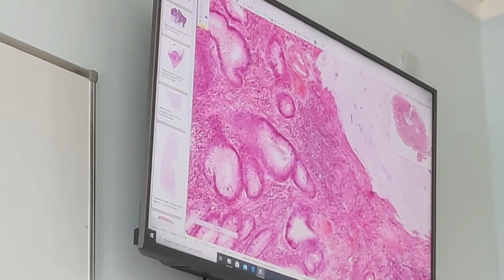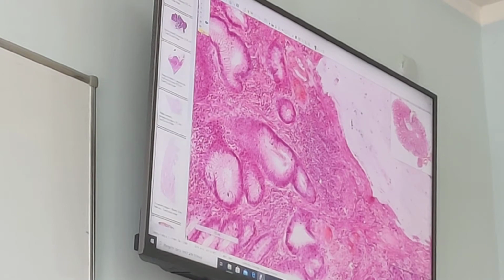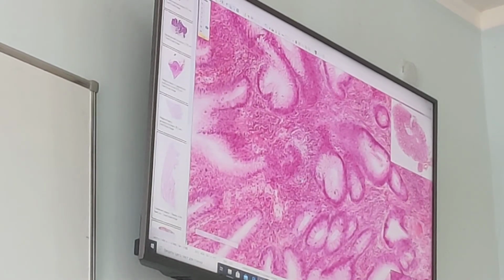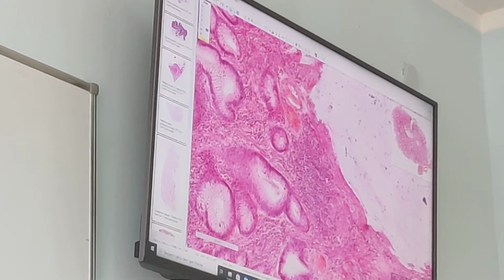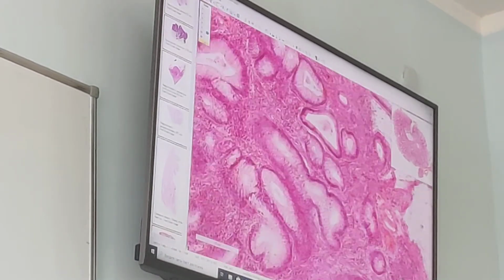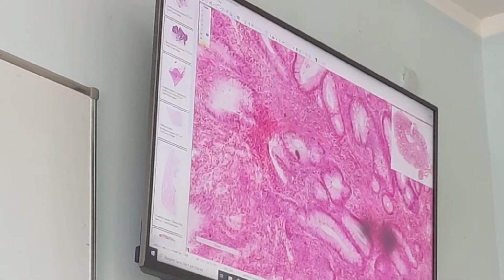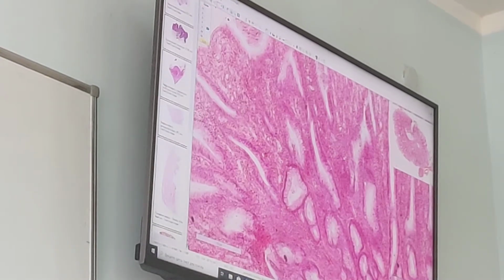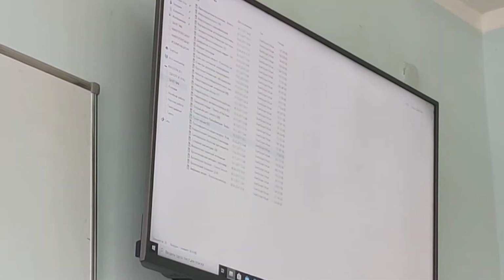Chronic inflammation is the main reason for polyp formation in any location of the mucous membrane. Foci of inflammation, it's not a single focus, these are multiple foci between the glands. Almost everywhere you can detect some lymphocytes and some macrophages. What else? Let's see, guys.